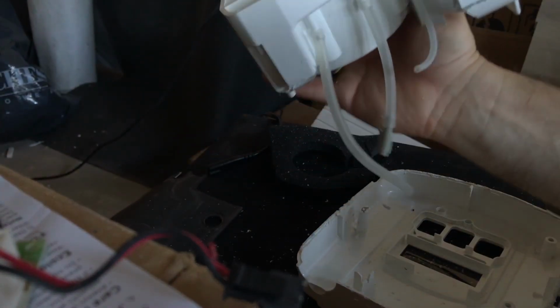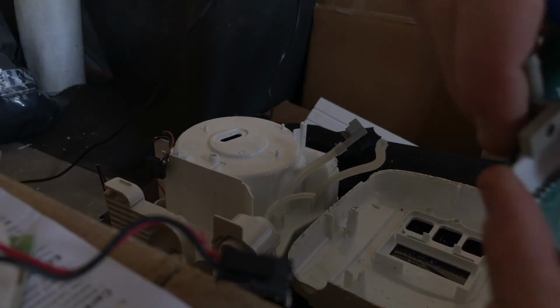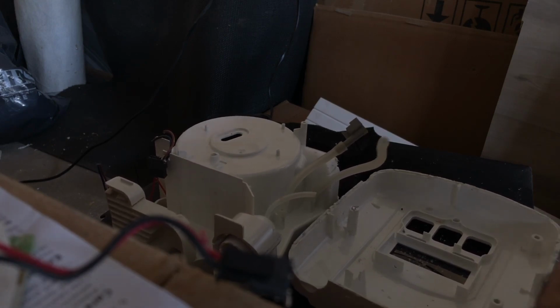Most of it is just made up of the blower motor and the air flow area, and some tubing to check for moisture or humidity levels, which go down to this sensor here. Might be also a pressure sensor. This is probably a pressure sensor here on the board. See that little thing there? And the one on the other side, or where was it? This one, I believe that's probably for humidity. But let's find out. Might be able to open it and see what's in here. It goes down to some kind of a package that I'm destroying at the moment.